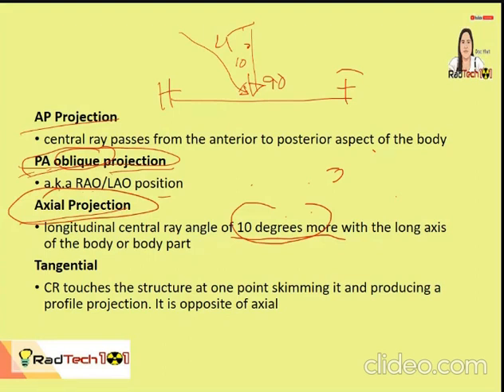So the patient is not rotated. Instead, the X-ray tube is being adjusted, is being angulated 10 degrees or more.